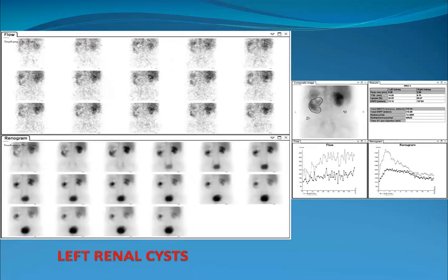A case of left renal cyst, as we see here. There is a photopenic area occupying the upper half of the left kidney, which is the renal cyst.